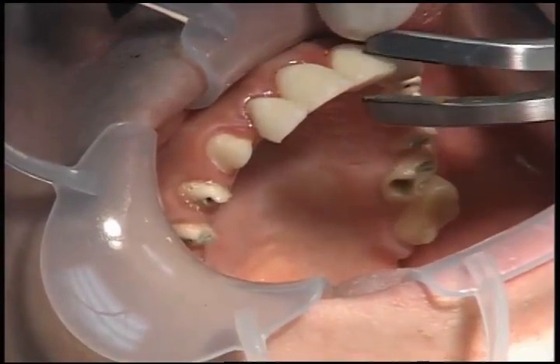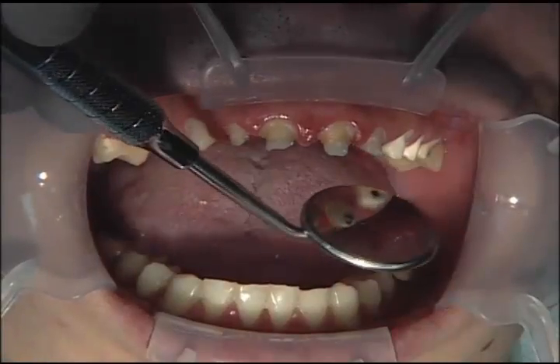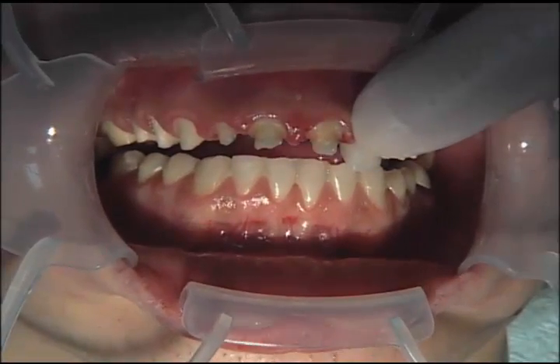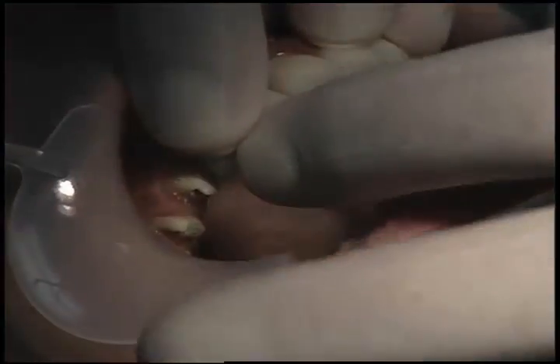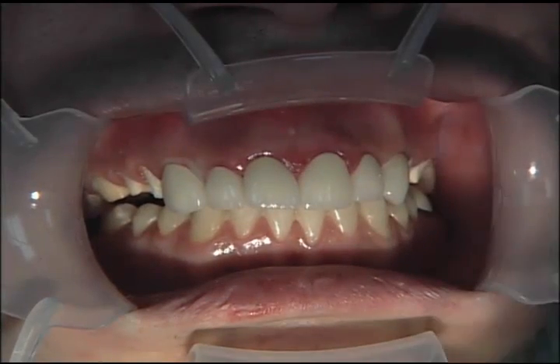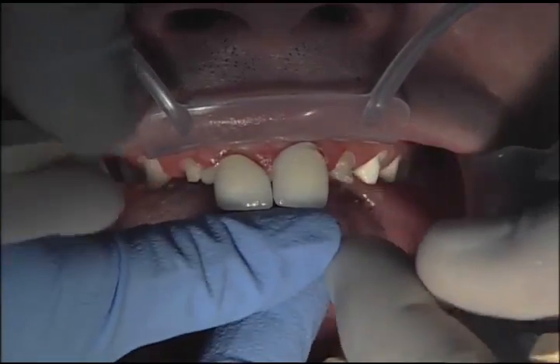Because it's a PFM, we can have the patient bite together at this point and check to make sure that the occlusion is very good or very close to where it needs to be. If these were all-ceramic restorations, we would have to treat this a little more gently. Now that we've tried in the posterior units, we remove the anterior biotemps and try those in. We take a digital x-ray to verify the marginal fit on the mesial and distal — the two areas that we can't check with the explorer. I'd much rather find out at the cementation appointment that I have a unit that doesn't fit than at a hygiene appointment. There are plenty of times where we put in all the units except for one that needs to be remade, and then we know at recall everything's going to look good.